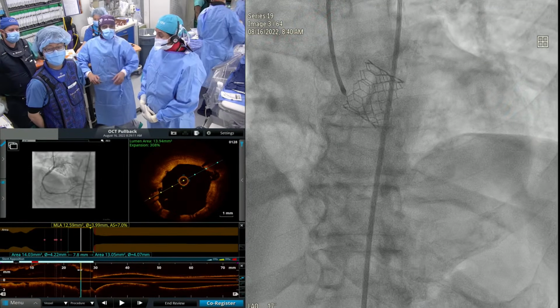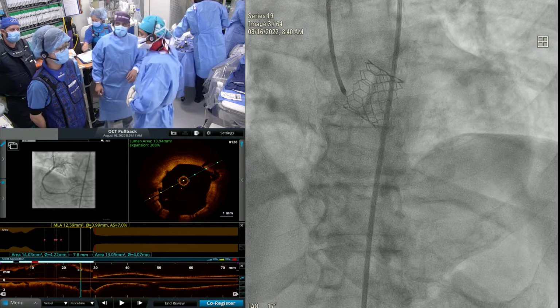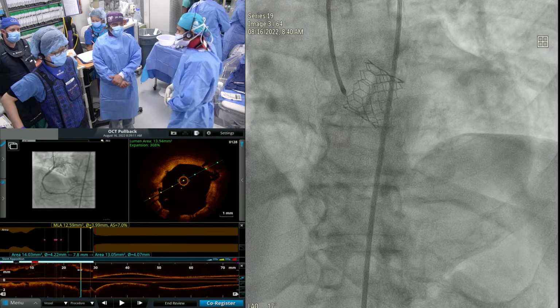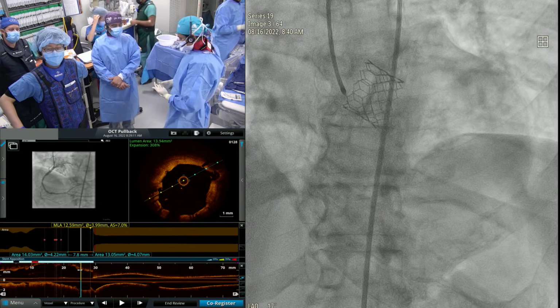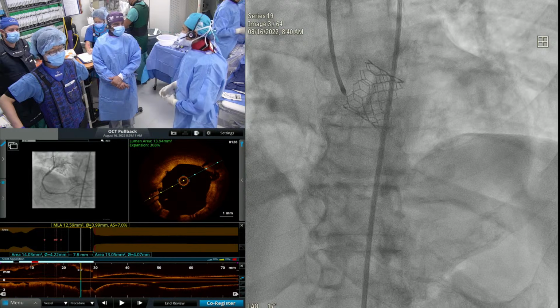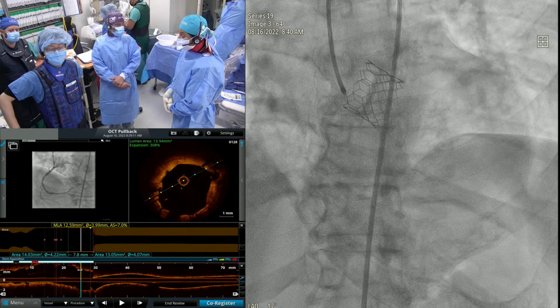I know Anu is shaking his head, and Kiski, about what the data are, but I'm just saying the literature. Right, I think it's not clear. Pictures are not as clear as we think, and arrhythmia is still higher. Anu, right? What about diluted contrast?